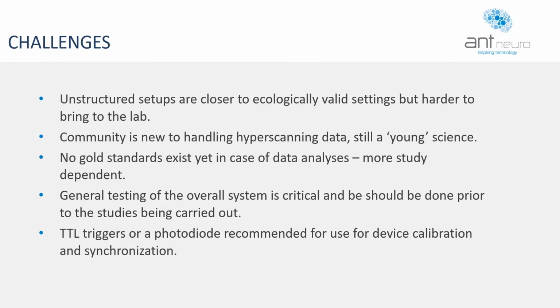Like I said, the goal is to bring naturalistic settings to the lab, but that is harder said than done. Secondly, the community is very, very new to handling hyperscanning data. It is still what we would call a young science. And this poses its own challenges because there are no gold standards that exist in the case of data analysis. It remains more study dependent.